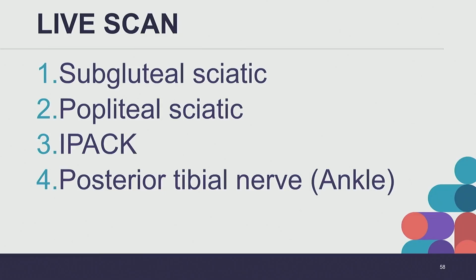And I usually scan up and down and just see if there's an area with a little bit more space to maneuver my needle, because she's got a little bit of a tight window between the artery and the bone. So this would be our window right here. Infiltration between the popliteal artery and the posterior capsule of the knee, IPAC.